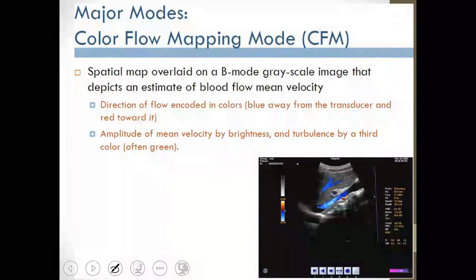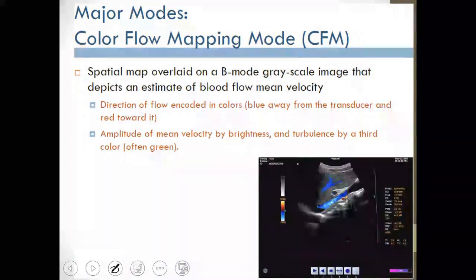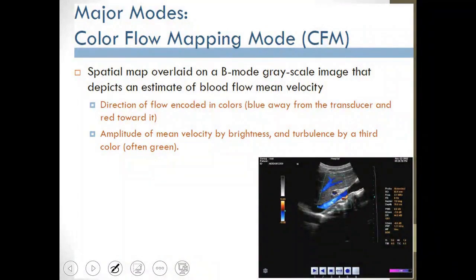When the reflected intensity of the ultrasound increases significantly in these specific areas, it starts encoding and integrating the incoming signal onto the image itself. We can see a very high intensity level present within these particular zones, and it begins to incorporate the signal it receives onto the image display using different colors.